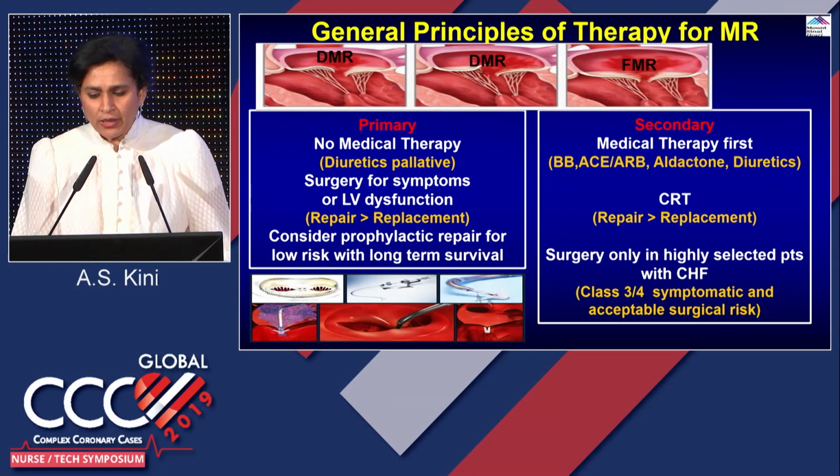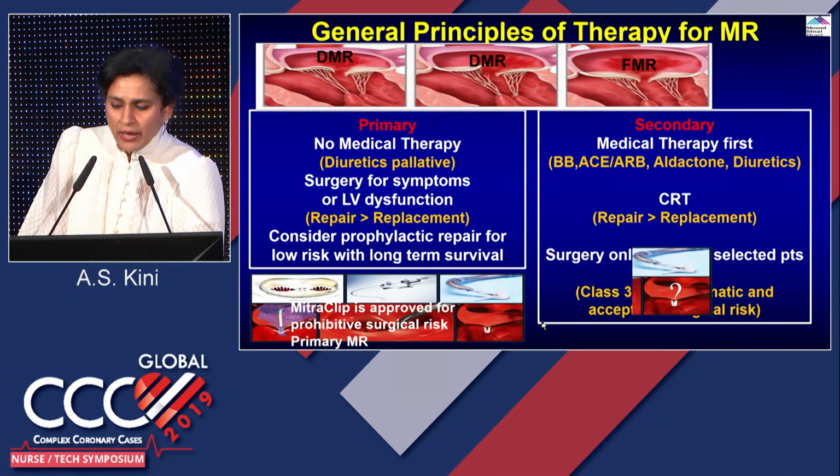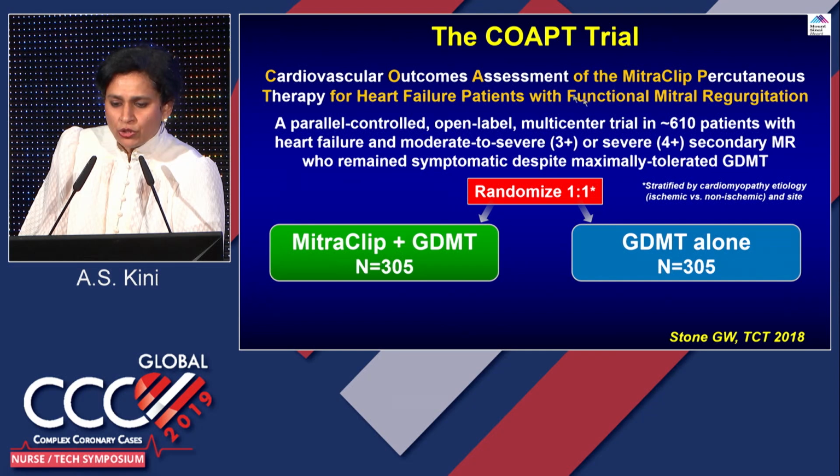So based on the trial called the COAPT trial, which was also presented, which showed that, we do not have the approval yet. What was the COAPT trial? Randomization to MitraClip plus guideline-directed medical therapy.